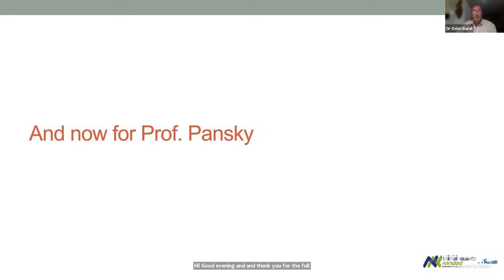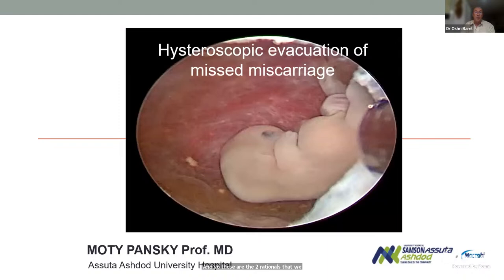As Dr. Barrel said, we knew that we were going a little bit into the minefield, because trying to conquer a very old and relatively safe procedure like D&C will create a lot of questions. But we are very confident that, first of all, the TrueClear is a good system. And the second is that we will join our knowledge with the under-vision procedures, as there is a worldwide movement now to do everything under vision. We agree that if it's possible, try to look at what you're doing. So these are the two rationales that we convinced our Helsinki committee with.